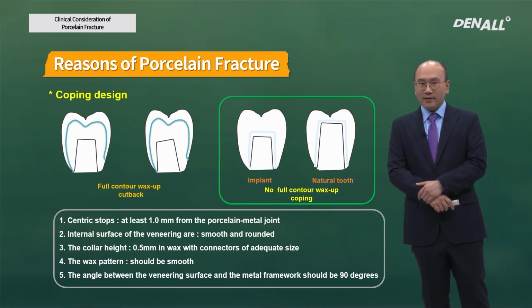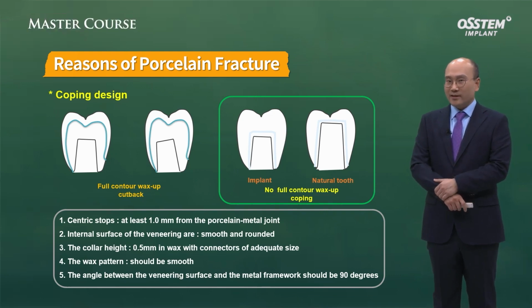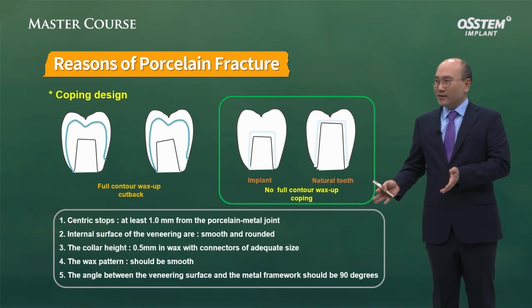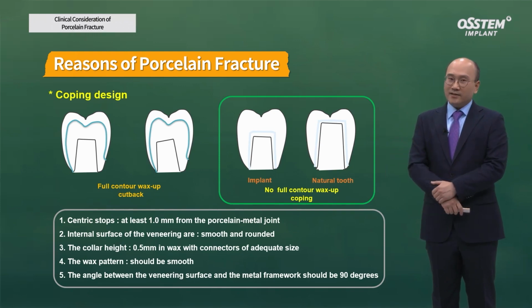For this type of porcelain buildup, if it's done well, then you have to think about coping design. It's a one-step prosthesis. The coping is on the lower side sometimes, so you don't check. But in reality, for the porcelain to be sustained, 1.5 to 2 millimeters would be the max for veneer porcelain, and there should be a coping design that can give good support.